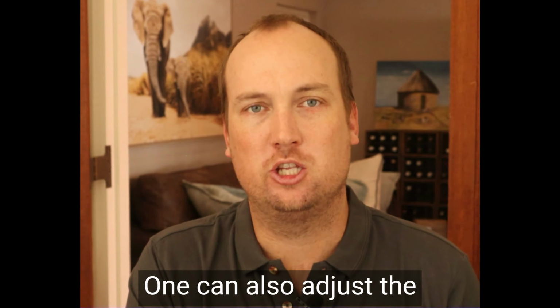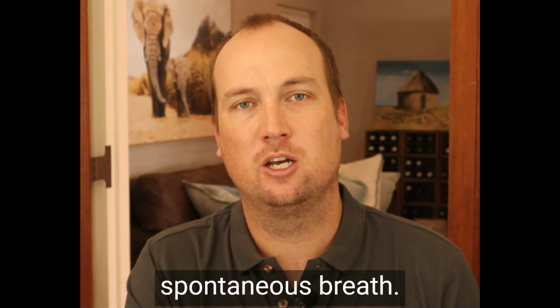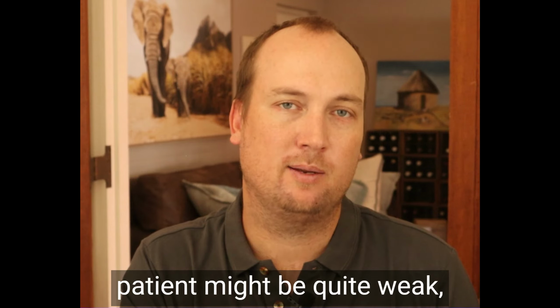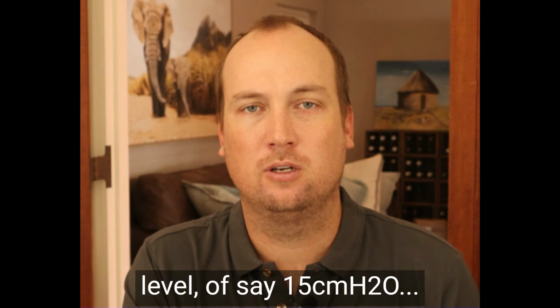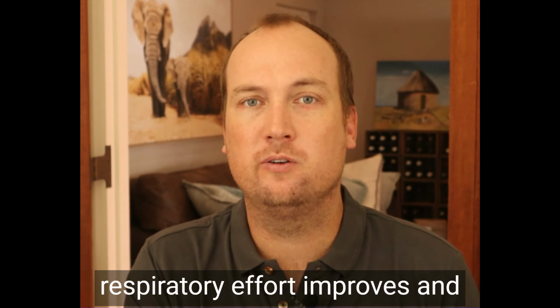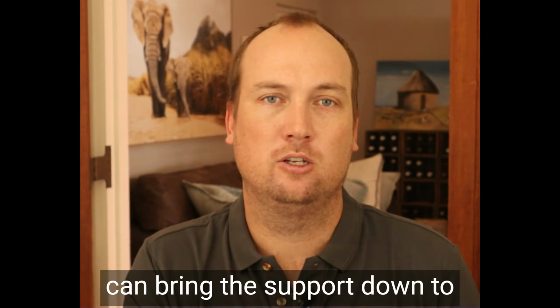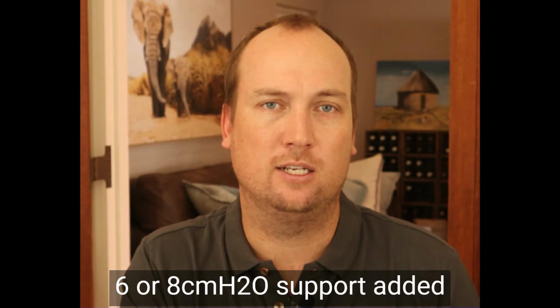One can also adjust the support given to each spontaneous breath. So again, initially, when the respiratory efforts of the patient might be quite weak, one can have a higher support level of, say, 15 centimeters of water. But then as the patient's respiratory effort improves and the tidal volumes improve, we can bring the support down to 6 or 8 centimeters of water support added to each spontaneous breath.